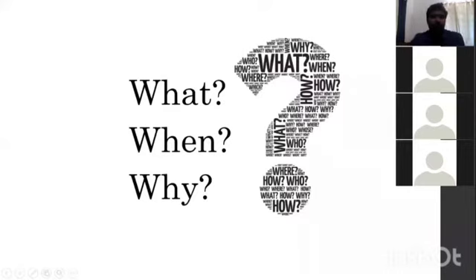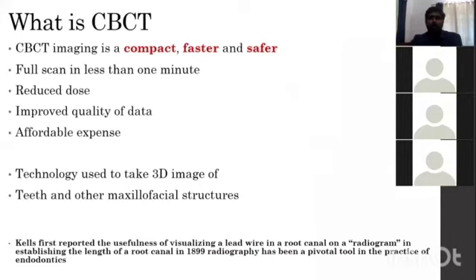A frequently asked question when referring a patient to CBCT was what is CBCT, when CBCT should be referred, and why CBCT can be taken. First of all, we have to know what is CBCT.